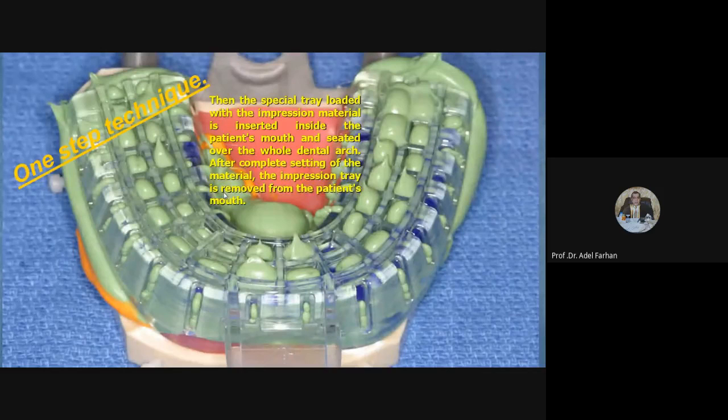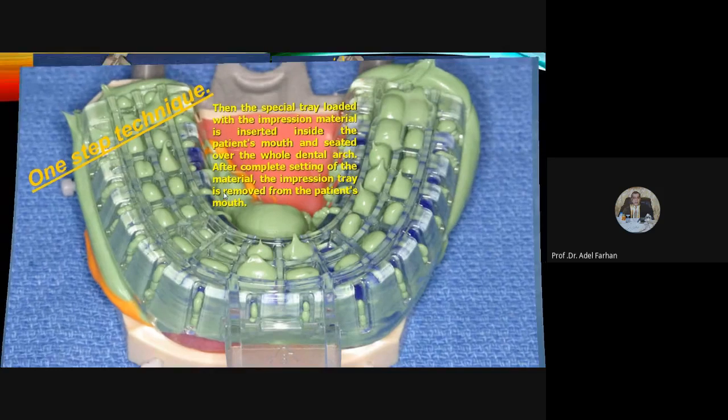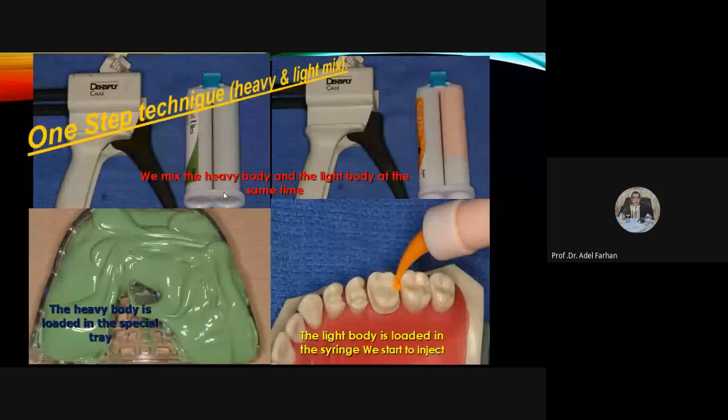Then you inject part of this material by the syringe over the dental arch, you insert the tray inside the patient mouth and seat it over the dental arch. فصار عندنا بعد ما يصير سيت امبريشن للدنتال ارش. هذا نسميه شنو؟ One step impression technique، اوكي؟ او مونو one step mono phase، يعني one viscosity.